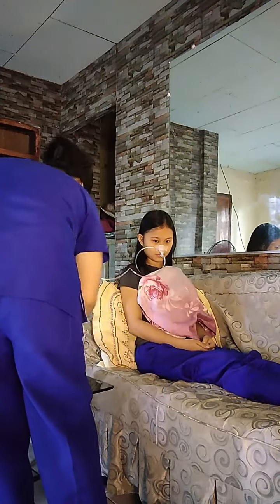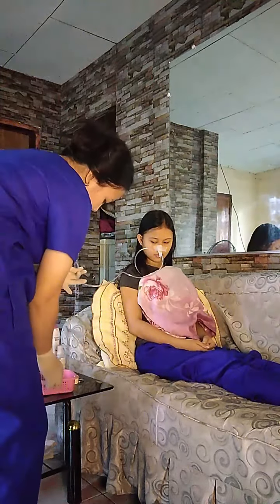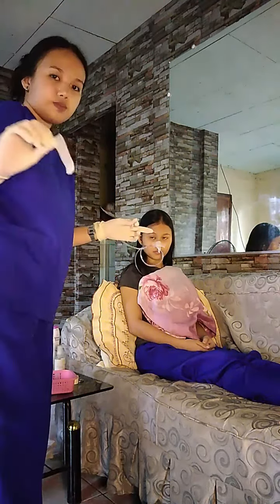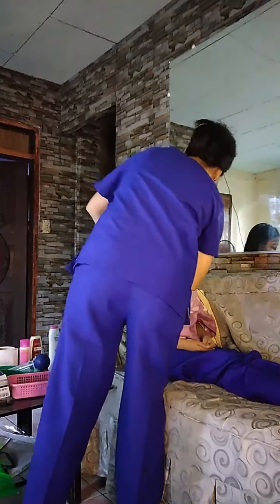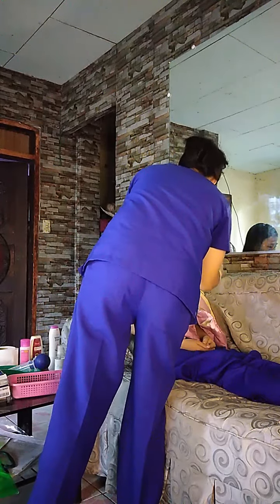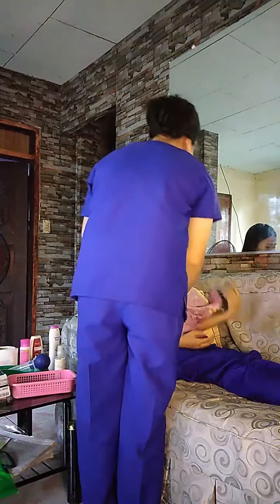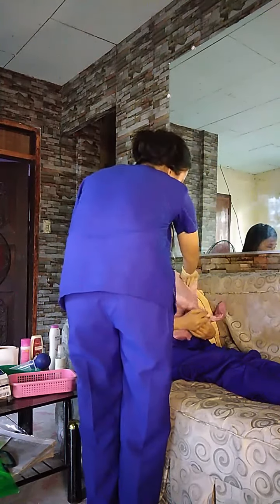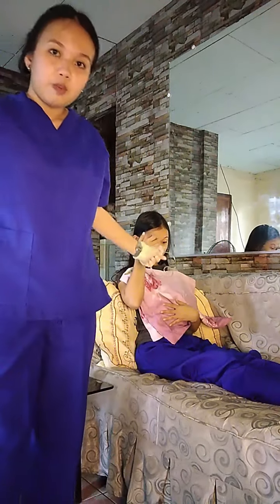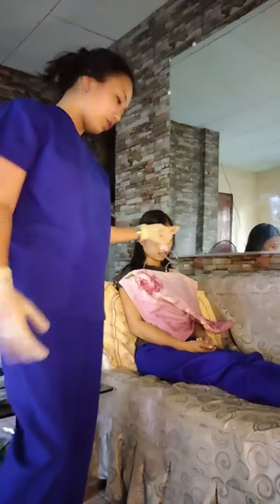ang susunod kong gagawin is iti-tape ko na while kinking the tip of the tubing, i-secure ko na yung tubing sa gown ng patient. So, pagkatapos nating i-secure, ayusin ko lang yung towel ni ma'am. And then, magpo-proceed na ako agad sa GAVAGE. Since yun yung order ng doktor.